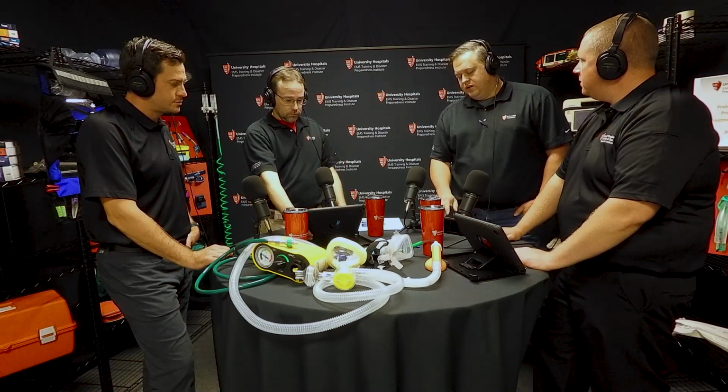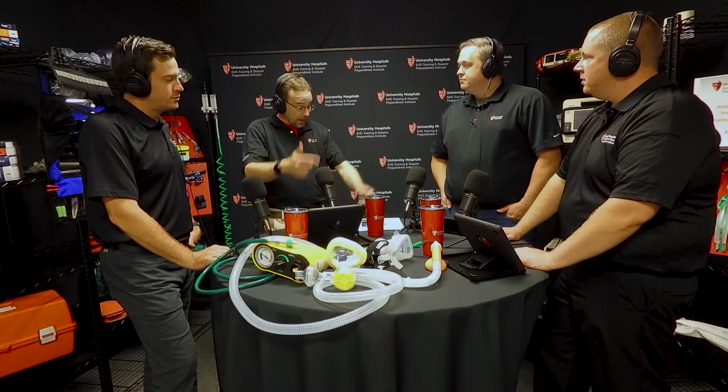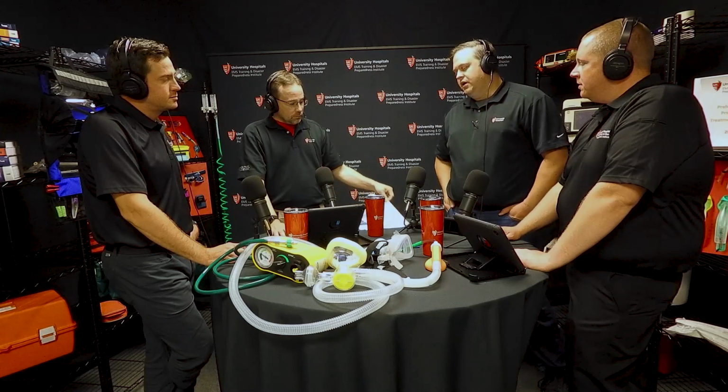My last one is probably not one we have great data for, but there's meta-analysis to suggest that even in blunt chest trauma, it's in the protocol. That's what I was alluding to earlier. So for those patients that a non-rebreather's not cutting it and you want to give a little bit of positive pressure, CPAP is appropriate. But just be mindful that if there is any injury to that lung tissue, you're going to have a higher risk and a quicker deterioration with a tension pneumothorax.